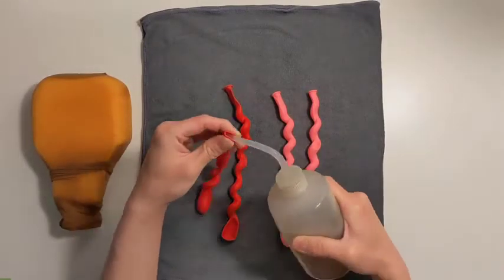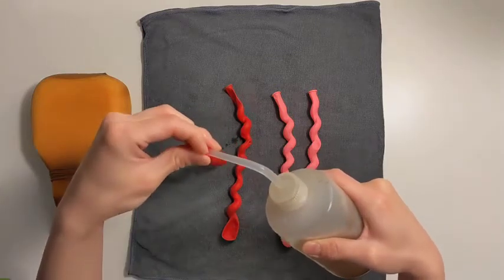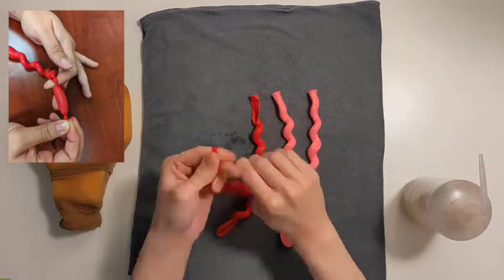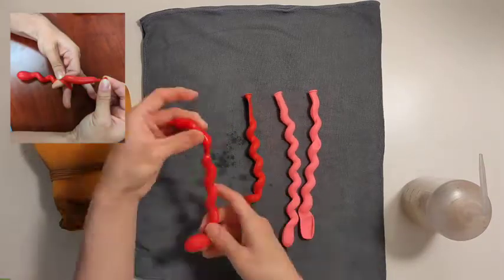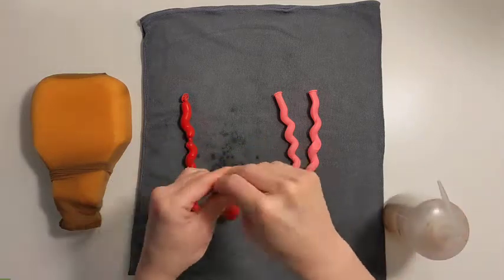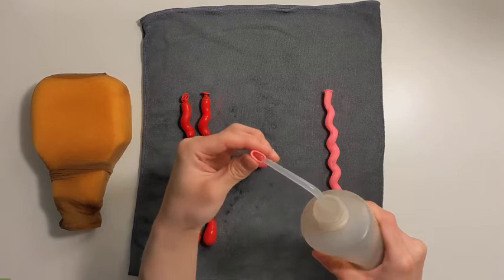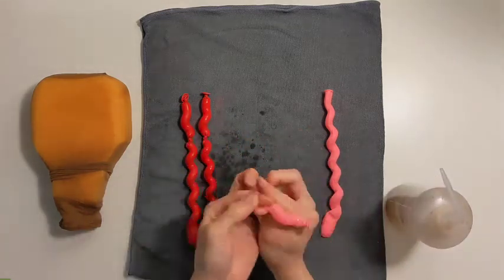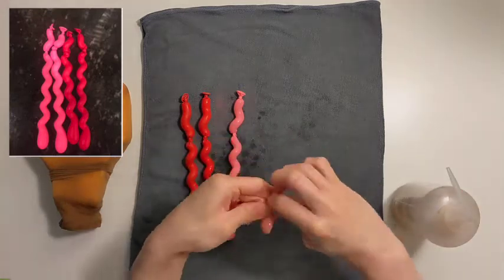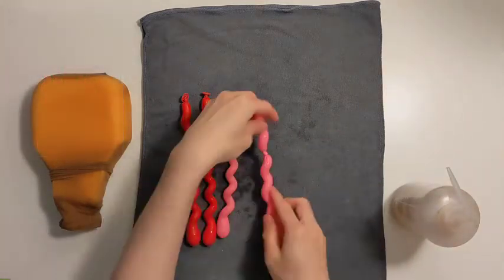Fill 2 pink and 2 red spiral balloons. This can be done using a pipette or even with a trickle of water from a sink faucet. Make sure the balloons are filled as much as possible. Then tie off the end by wrapping the end around 2 fingers. After tying off the end, make a second knot about 2 to 3 centimeters below the first knot. When doing this, ensure that both ends of the balloon are filled with water. The shorter end will simulate the utero-ovarian vessels, and the longer end, the uterine vessels.